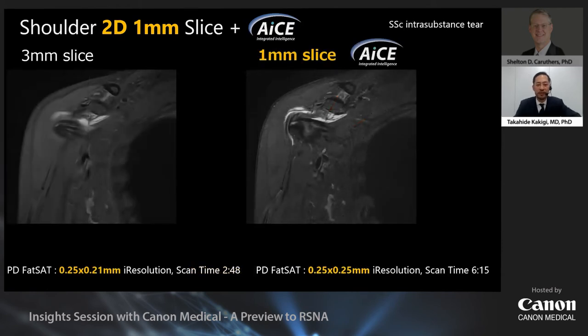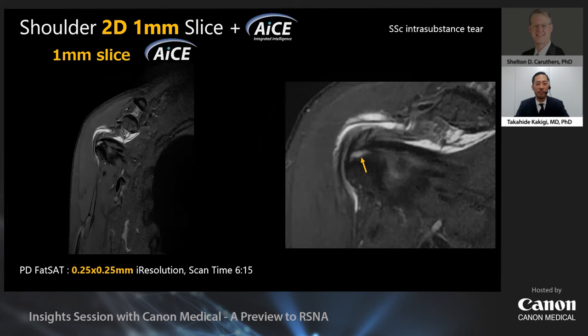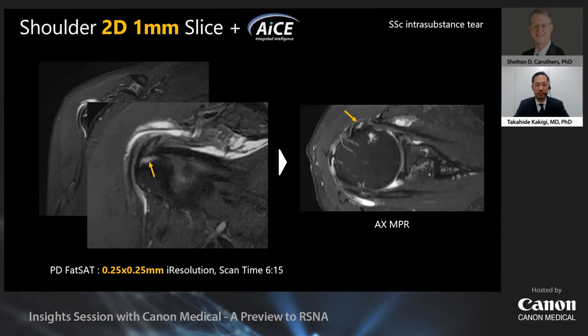Another patient: this is a comparison of 3mm and 1mm ACE images in a case of intrasubstance tear of the subscapularis tendon. In subscapularis tendon tears, the 3mm coronal image can show the region, but usually just one slice, making it difficult to diagnose with certainty. However, the 1mm coronal image can demonstrate the region with continuity, enabling a more confident diagnosis. Of course, the region can also be identified on the 1mm transverse MPR image. If the region can be seen from two different directions, we can be more confident in the diagnosis.